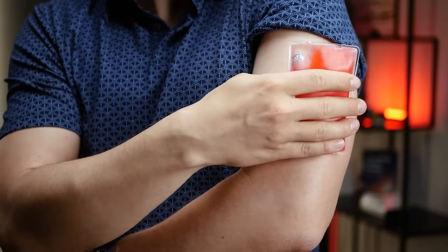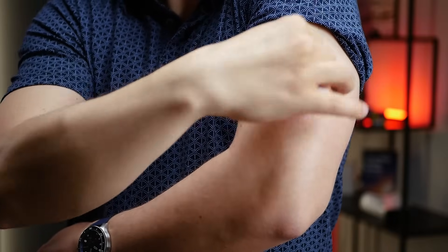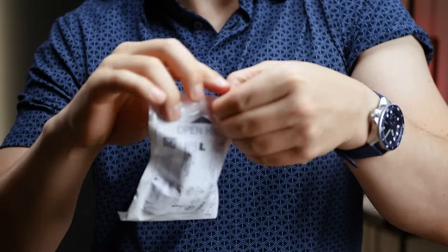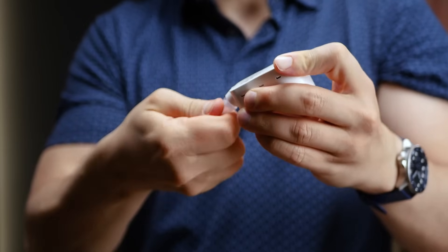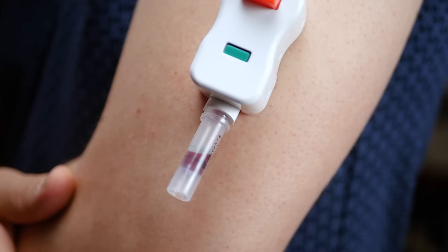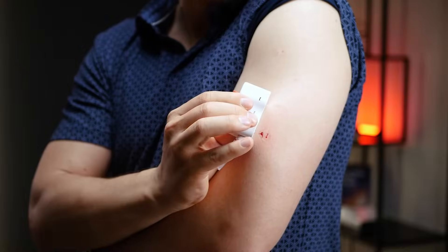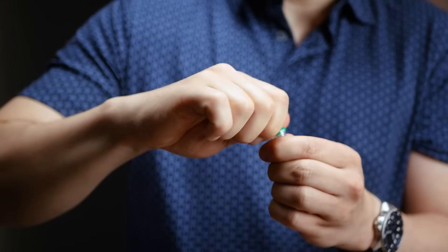Just like with the first device, we activate and apply the heat pack to the upper arm for one minute, then clean the area with the provided alcohol wipe. We attach the RedDrop device to the warmed area, slide the actuator to begin collection, and once the sample is collected — indicated by the same fill line — we remove the device and prepare it for mailing.